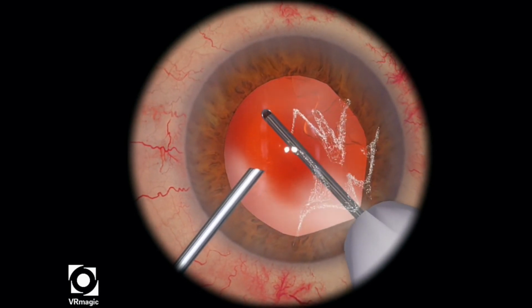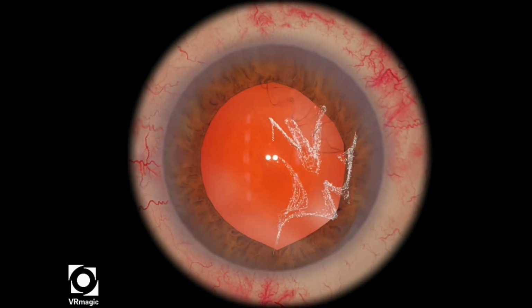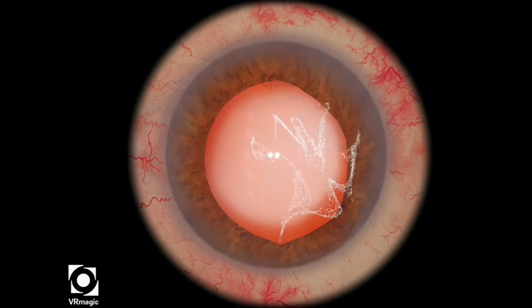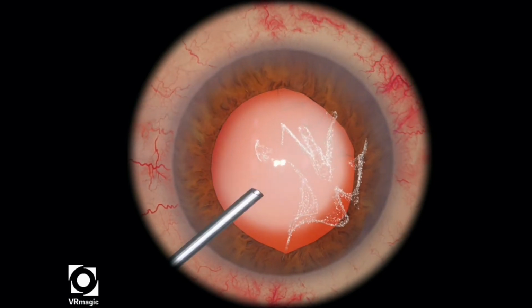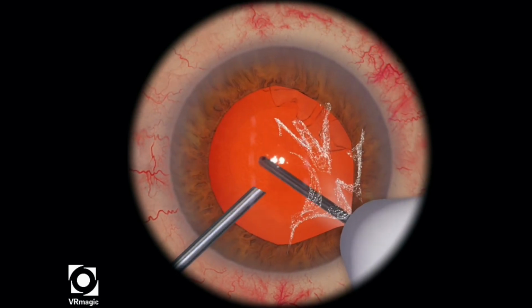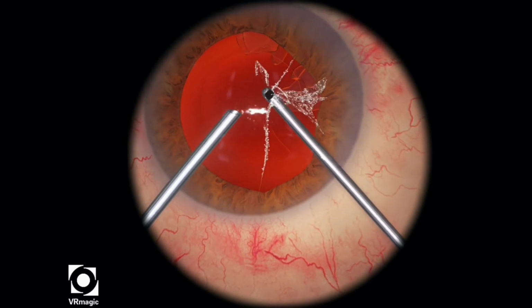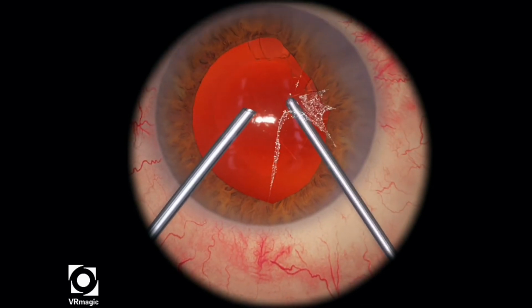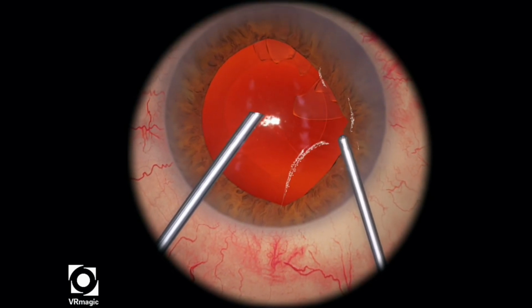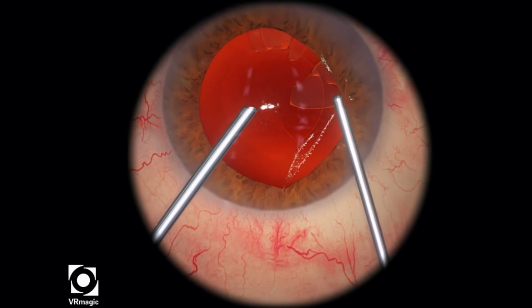And again, my settings are relatively high aspiration settings, and also high cut rates as well. I'm staining a little bit more just to make sure that there's nothing below the posterior capsule that I've brought forward, and then I'm just chasing after the rest of that vitreous. Now I'm going to go after the pieces, and look how adherent it is to the iris. It's even bunching the iris up a little bit. So I'm just angling my cutter and turning the cutter almost a little bit facing towards the vitreous.